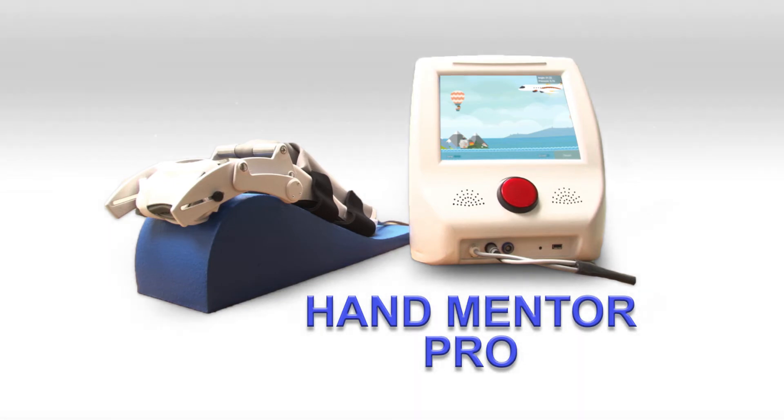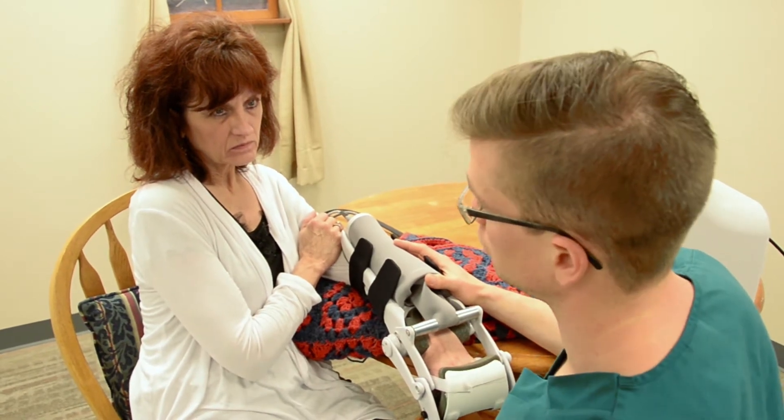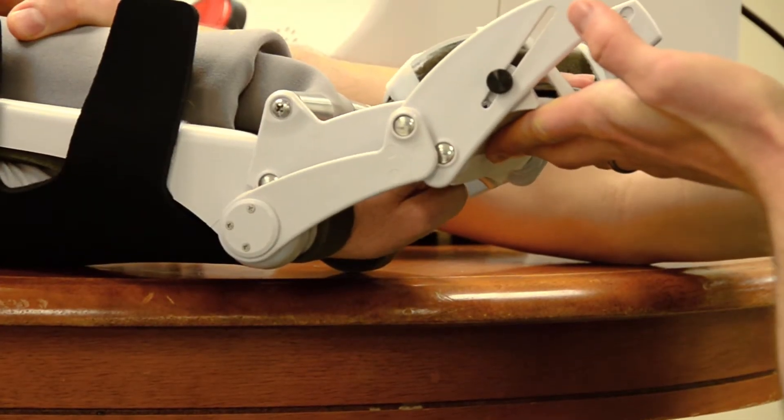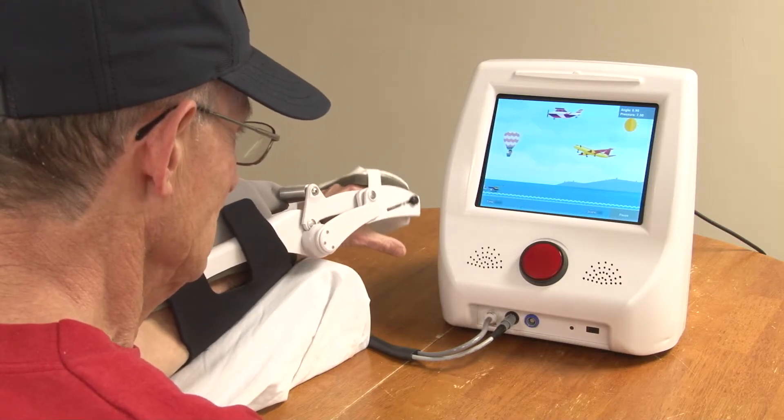Welcome to the HandMentor Pro Rehabilitation System. The HandMentor Pro is designed to help stroke survivors improve range of motion, strengthen, and enhance motor function, helping to reduce impairment and improve quality of life for the patient.